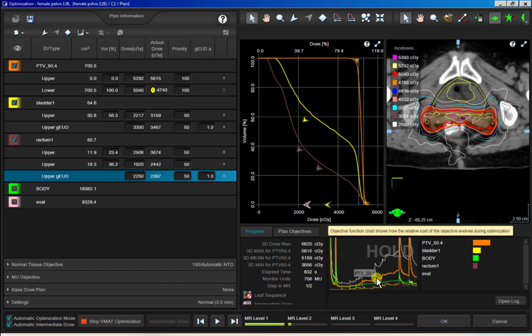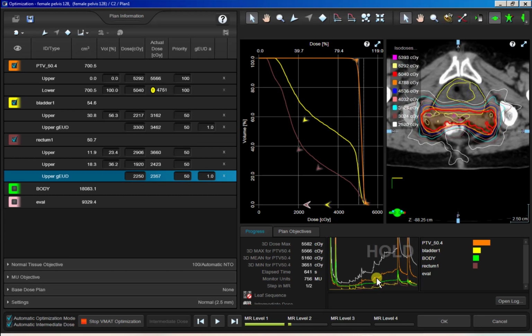But again, that all just comes with experience. It's going to be a big part of this semester too. Just repetition, getting used to the optimizer. You'll start to recognize patterns and figure out when you should let it level out completely, when you can kind of cheat a little bit and move on, things like that.